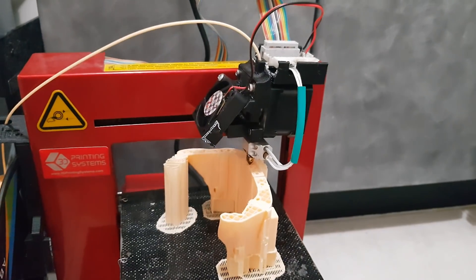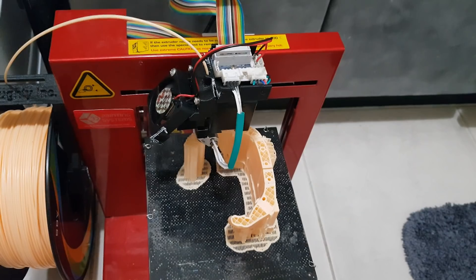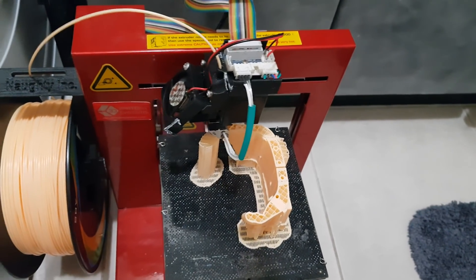This morning's fitting went really well. The candidate was pretty excited — he went straight into it and we were very surprised to see how eager he was to put the prosthesis on himself, jumping straight into picking things up. The silicone grip attachments that we'd put on the fingertips really helped with picking up objects like the glass. He was able to hold an apple, which was really cool to see. And then he was swinging a tennis racket around with the large tool holder. Everything worked quite well. It was really exciting and the family was really happy.